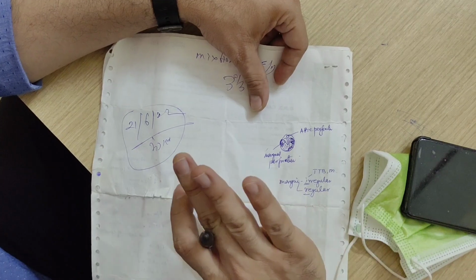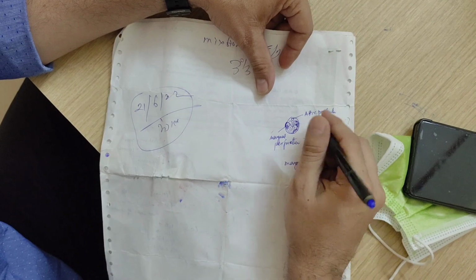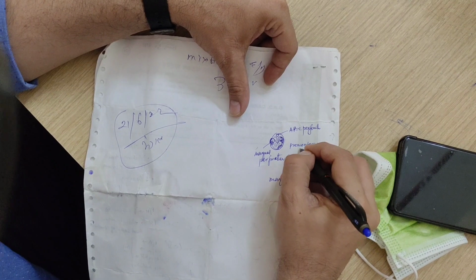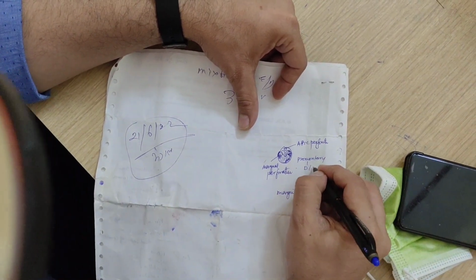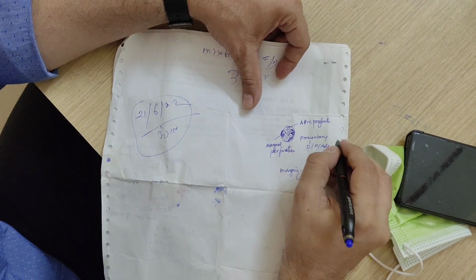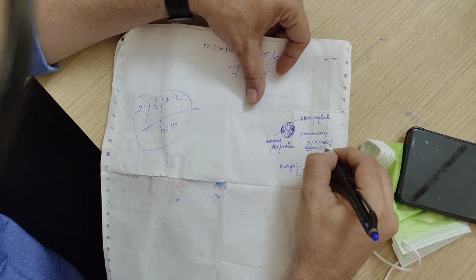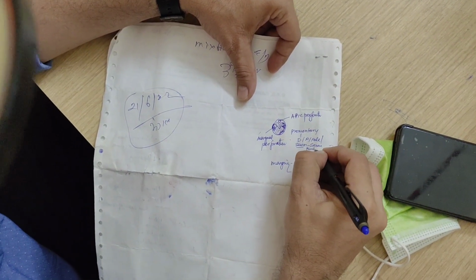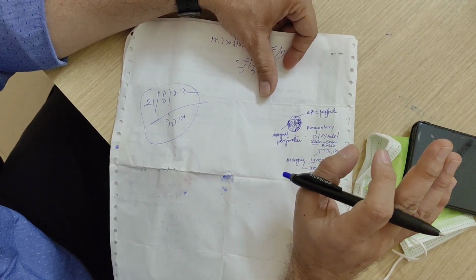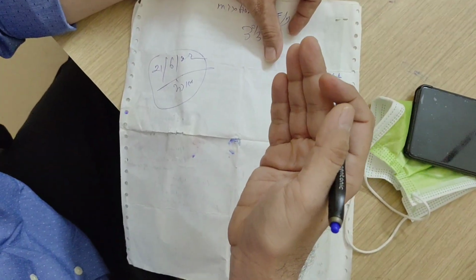Promontory is the mucosa that overlies the middle ear. Okay, that is the middle ear mucosa. About the promontory, you have to again comment whether it is dry or wet. Its color is pink or pale. If there are any secretions there, then what kind of secretions are there, serous or purulent secretions present on the promontory, or if there are any polypoidal changes on the promontory. The polypoidal mucosa makes the promontory bulgy.